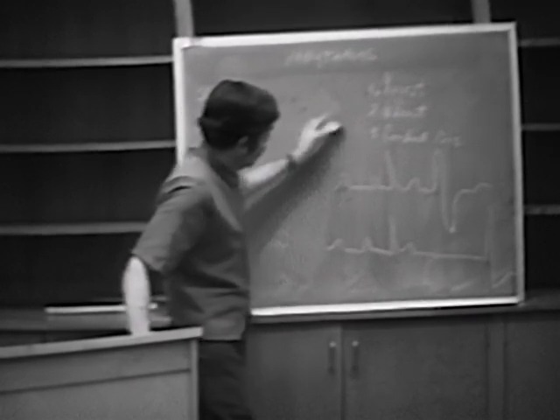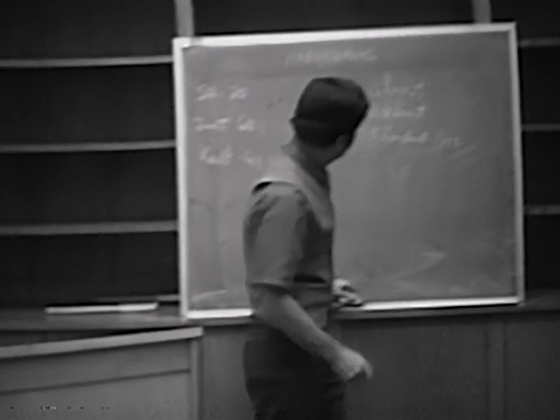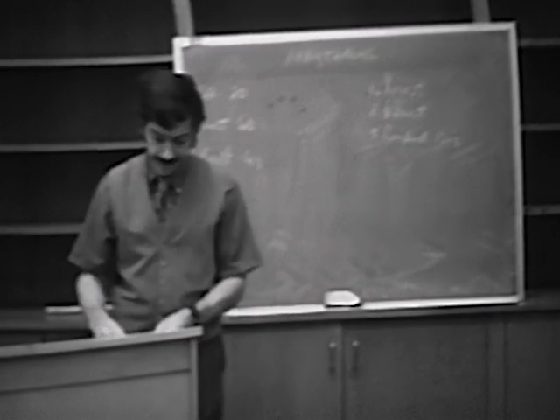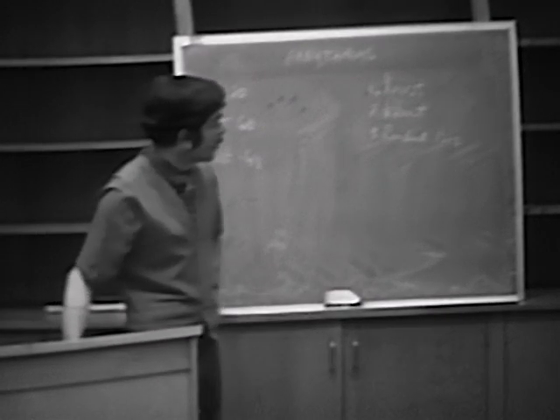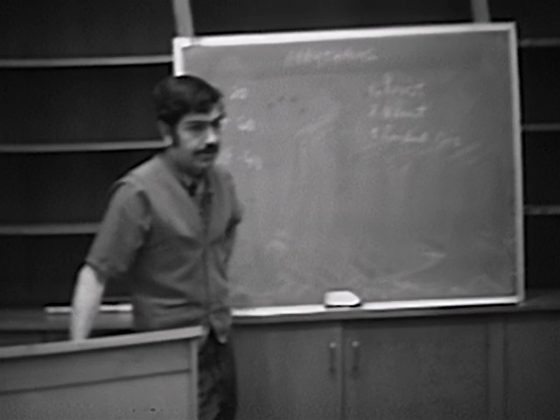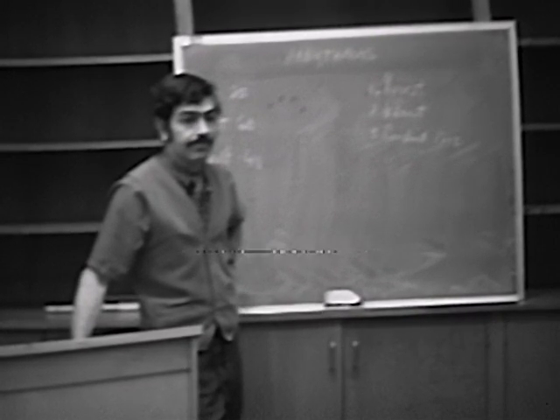Okay, now, this system of considering arrhythmias, really a function of these mechanisms outlined here, helps to explain, for instance, the toxic manifestations of digitalis in electrocardiogram, for example, digitalis toxicity.